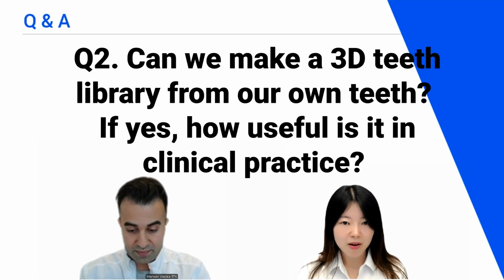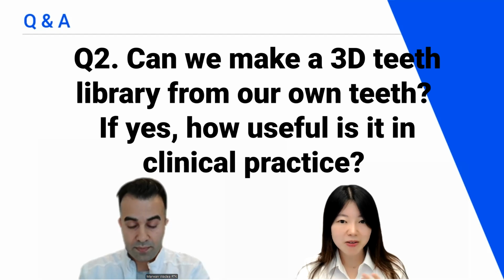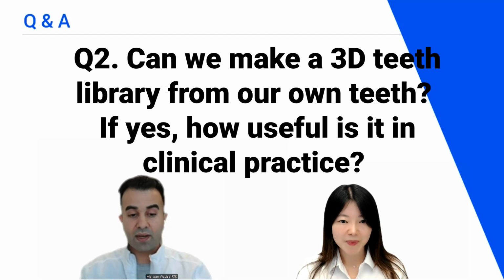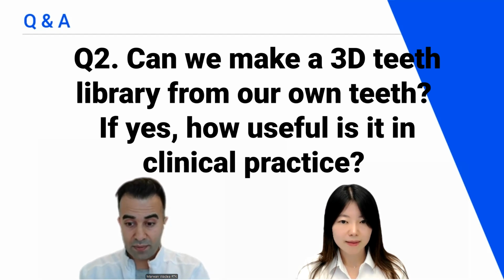Let's move on to question number 2. Can we make a 3D teeth library from our own teeth? If yes, how useful is it in clinical practice? Yes, 100%. So we can scan our own teeth, and we can follow the same steps that I demonstrated in this webinar to extract a 3D teeth library.